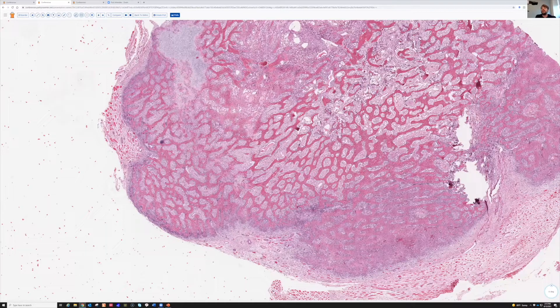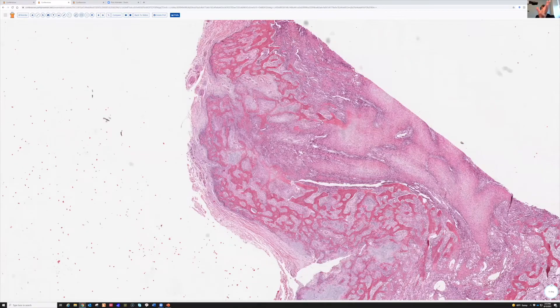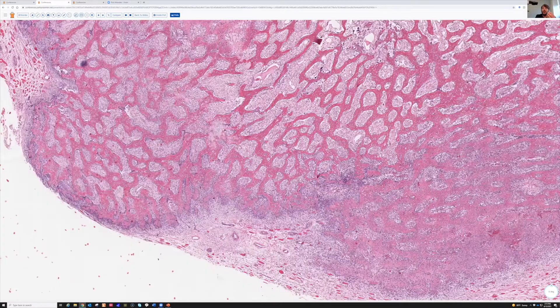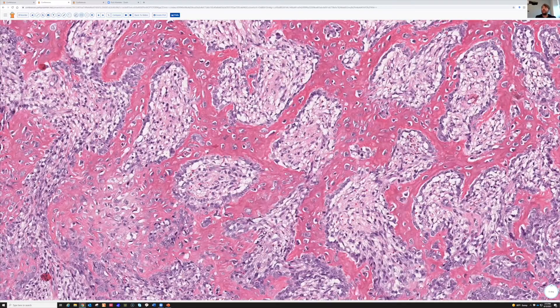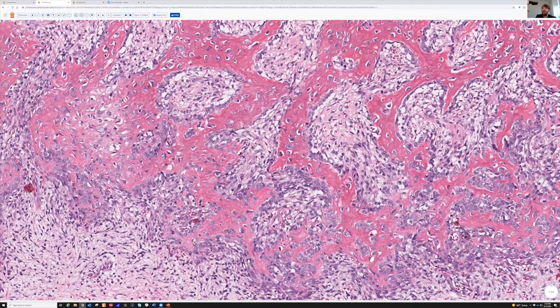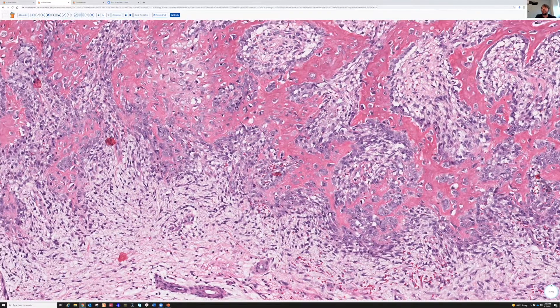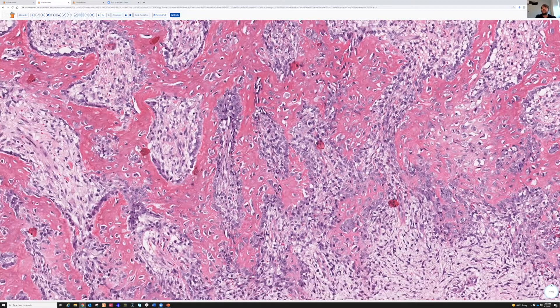It's a very busy lesion with a lot going on, so we have to break it down. The outside has a nice layer of bone all woven together - woven bone. At higher power you can see irregular little lines of collagen forming the osteoid. There are very puffy, large osteoblastic cells around the periphery of these little bone seams and also embedded in the center. They're very large and really stand out. It's very cellular around all of the bone.